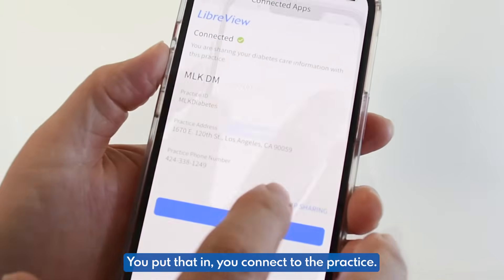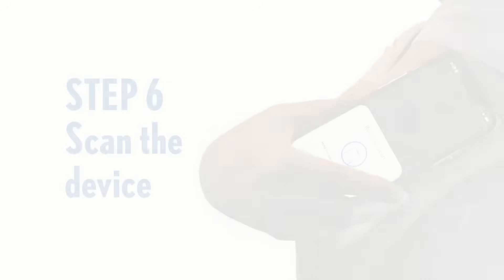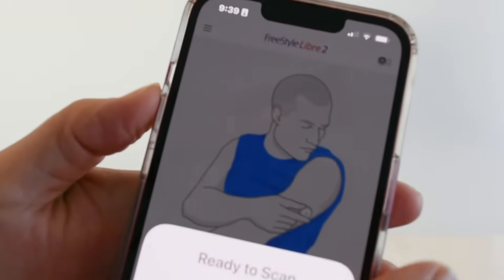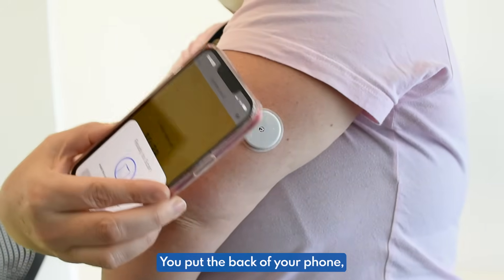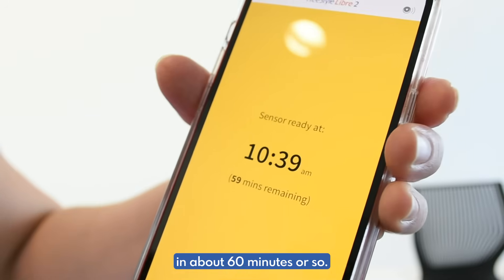You put that information in and connect to the practice. After that, you click the little circle and start your sensor. You put the back of your phone and hover it over the sensor, and it'll tell you that it should be ready in about 60 minutes or so.